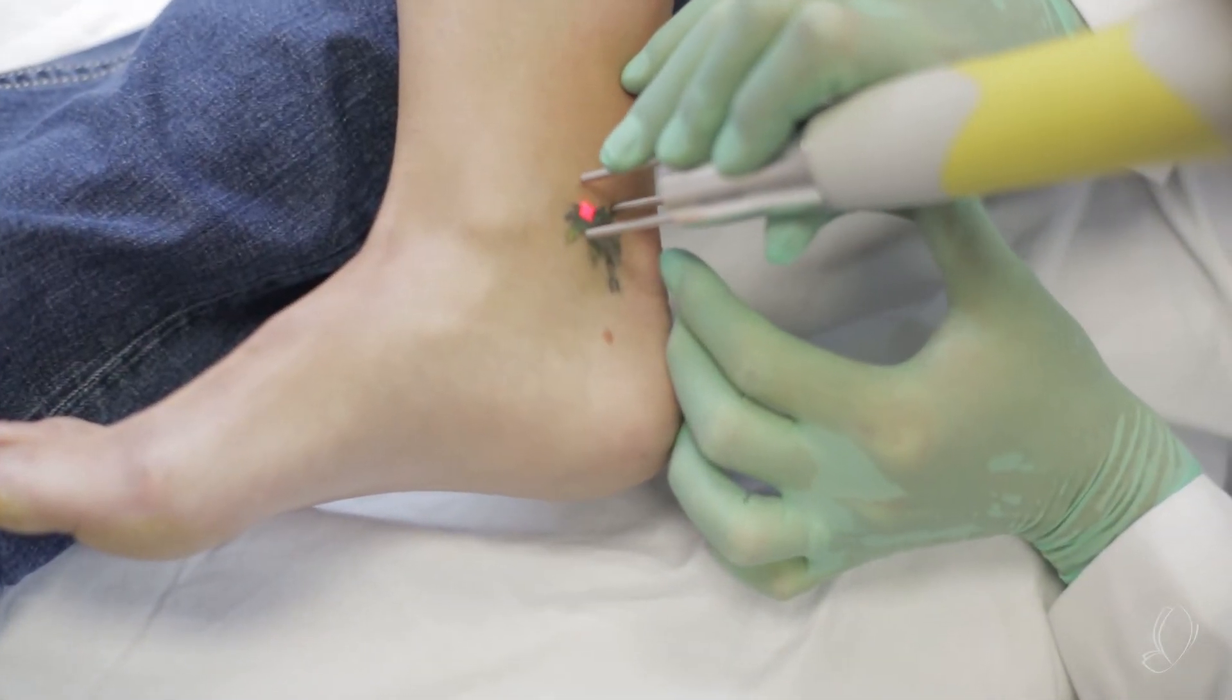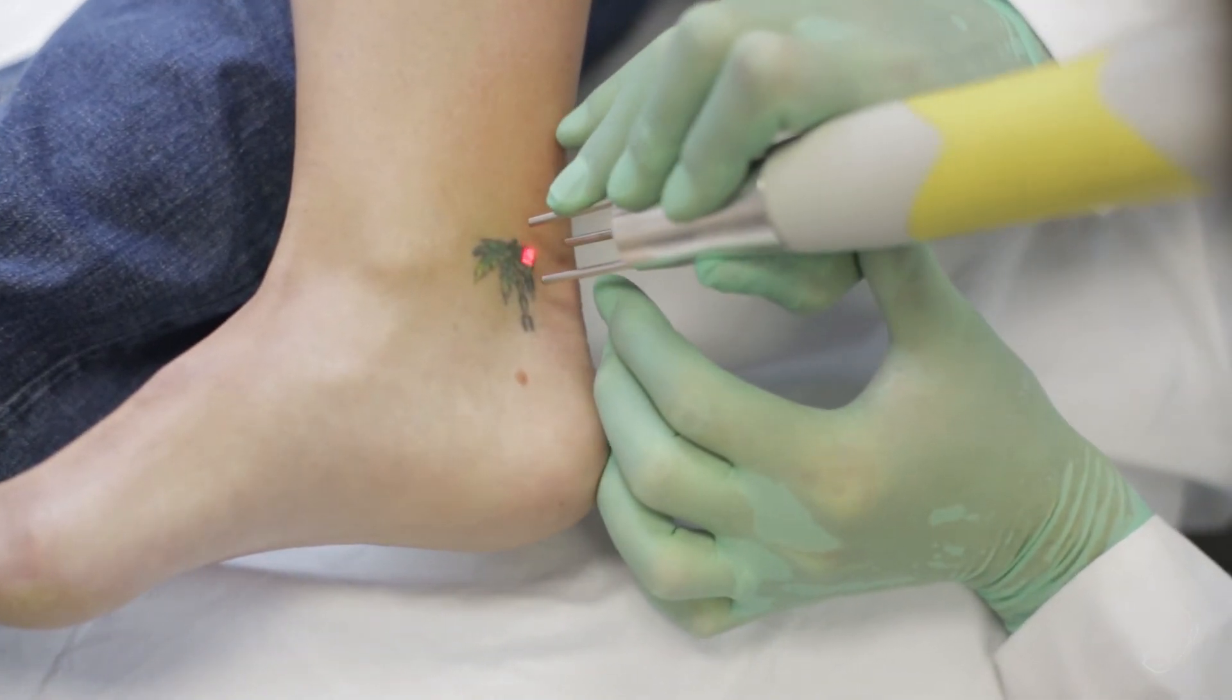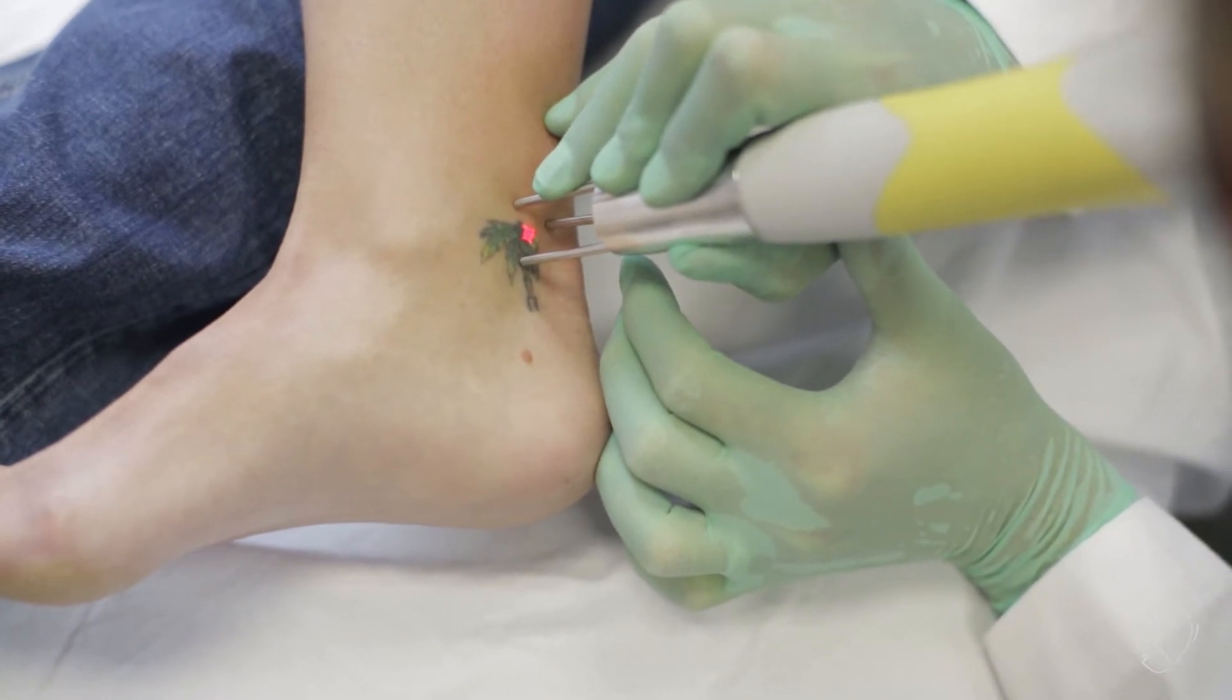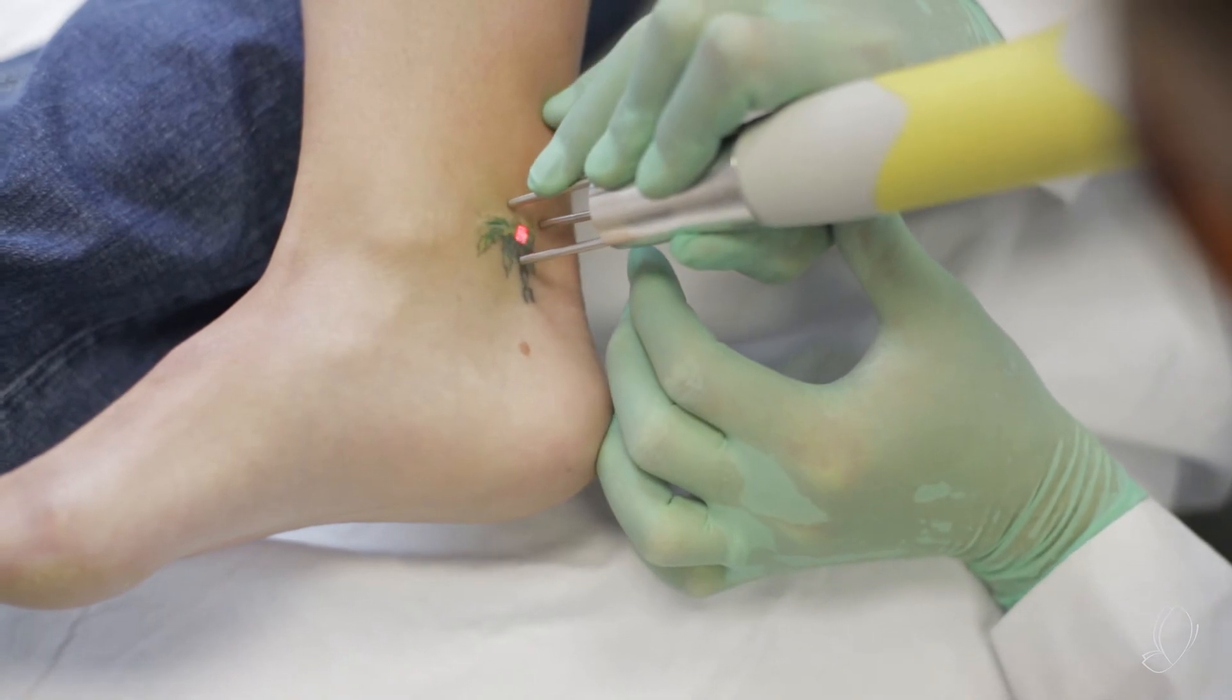I'm going to try to not have as much overlap, so I'm going to move fast, so we don't have to do too many treatments. Are you ready, Jessie? Yep. All right. Three, two, one. How are we doing? Good. Painful? Yep.